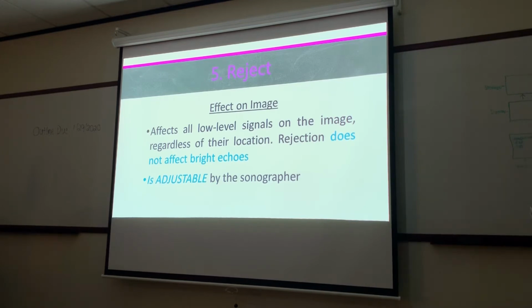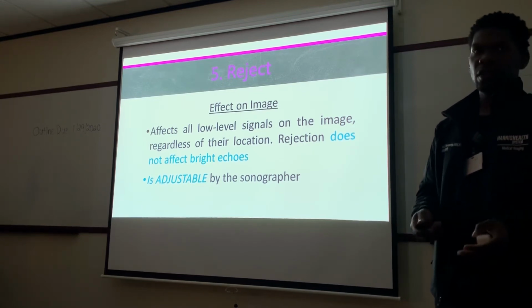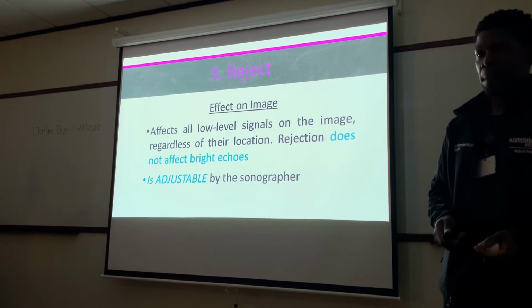Okay. Again, guys, it is adjustable by us. It is a button. The only one that's not adjustable is demodulation. Demodulation is the only one that doesn't have synonyms.